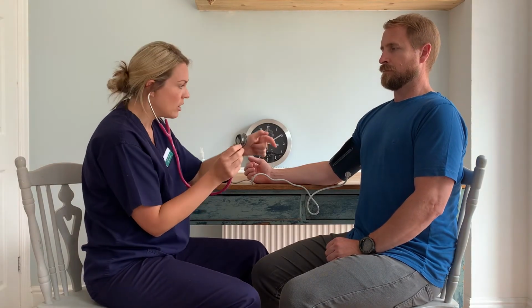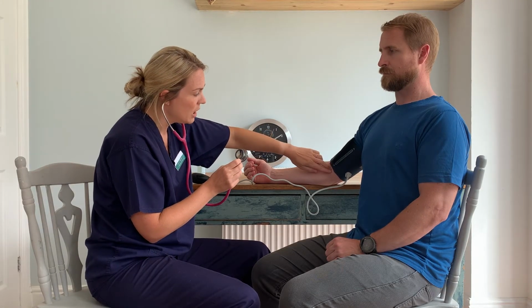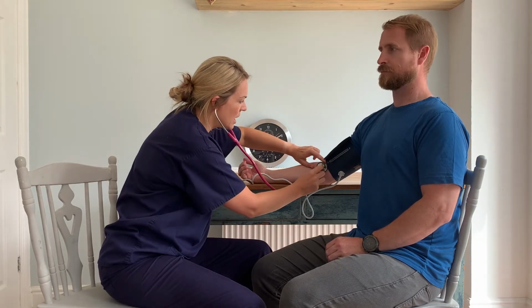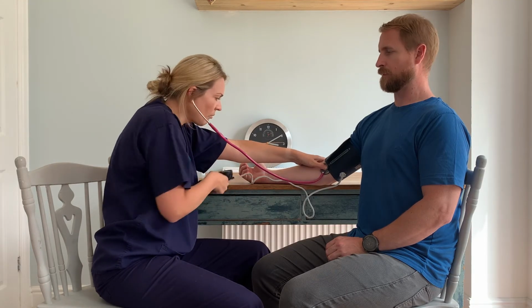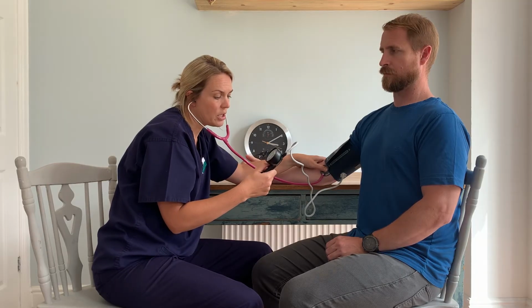Now we're going to use the diaphragm end to take the blood pressure. So we know roughly where that brachial artery is. We have our artery marker on it. So I'm just going to feel in that area again, and find the brachial artery there. So I'm going to place the stethoscope on the arm, hold it in place with my thumb, and take the valve here, making sure that the dial is now shut.